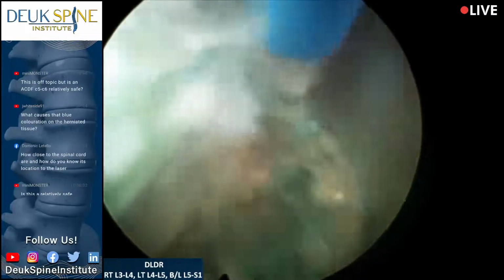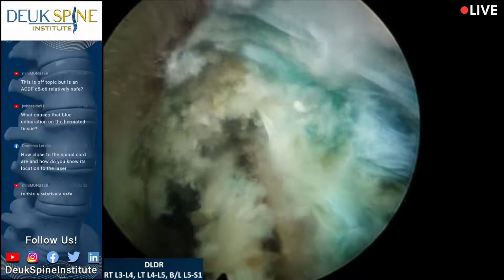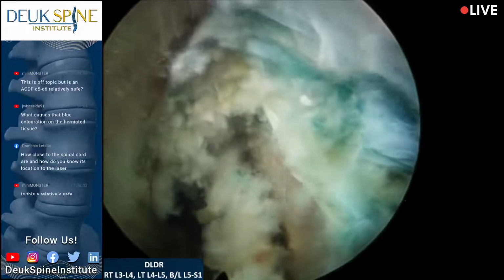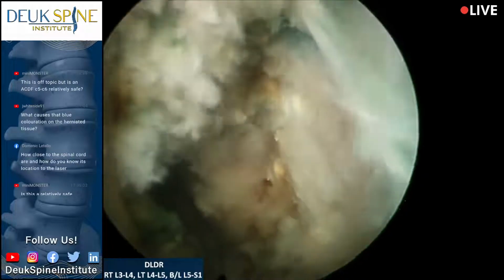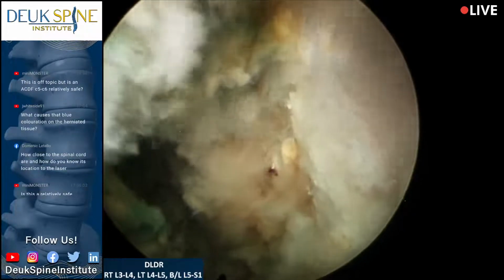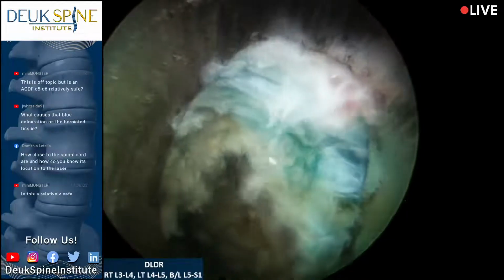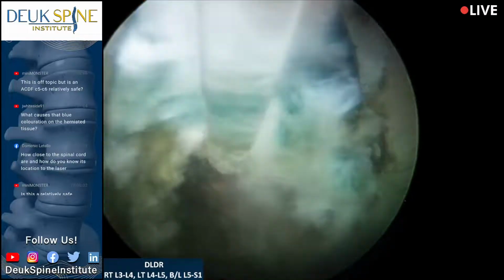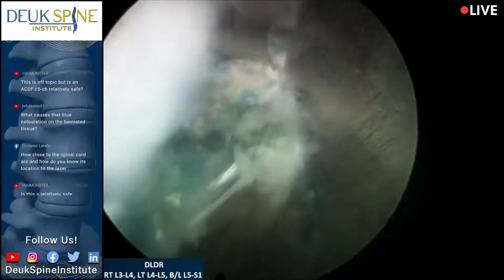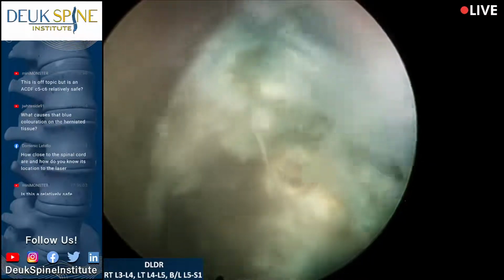So as long as I control the tip of the laser, I can make sure I don't do any damage to anything like the spinal cord, because I can see very clearly with this special endoscope. It's a high definition endoscope. I can see all the details of what I need to see so I don't cause any nerve damage or spinal cord damage. I would never blast the laser on the nerve or the spinal cord. I know where they are. I know what they look like. As a neurosurgeon, it's part of my training. We do surgery near the nerves and spinal cord all the time. That's what we do. And I've never had a nerve injury or a spinal cord injury in my surgery, ever. Not even with my fusions.